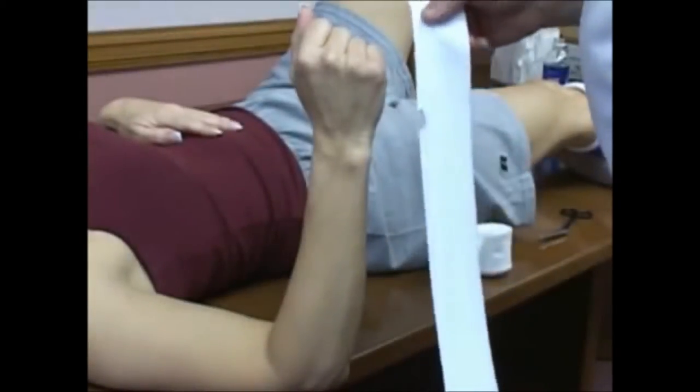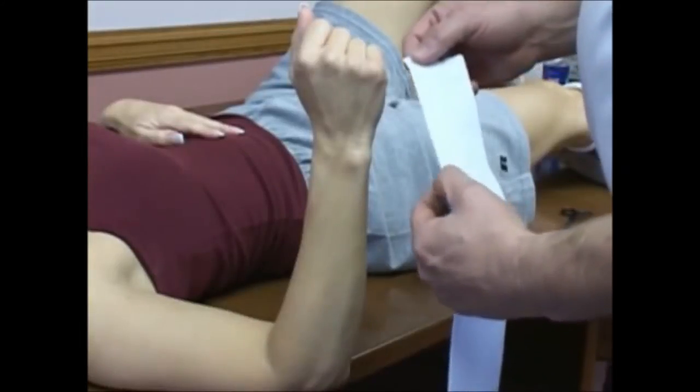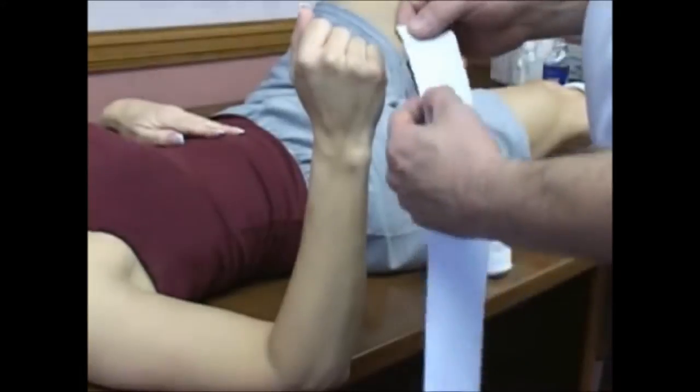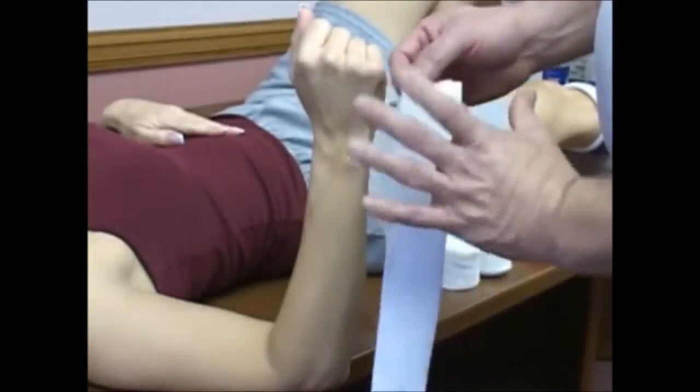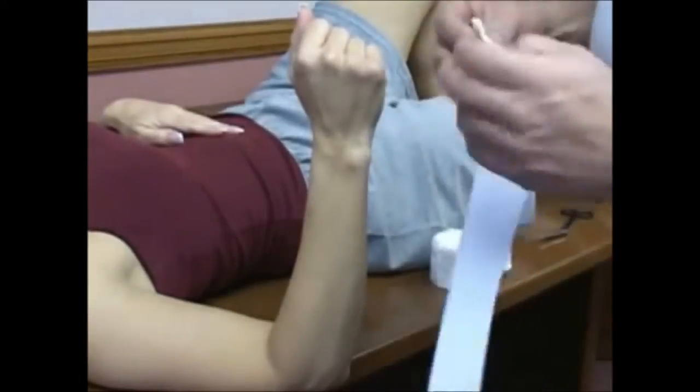We're going to be doing a short arm cast next. I like to cut the thumb hole several inches down on the stockinette. The simple reason is if you cut it too short, when this expands out, you'll have it way up here. I'll show you what I mean in a few seconds.